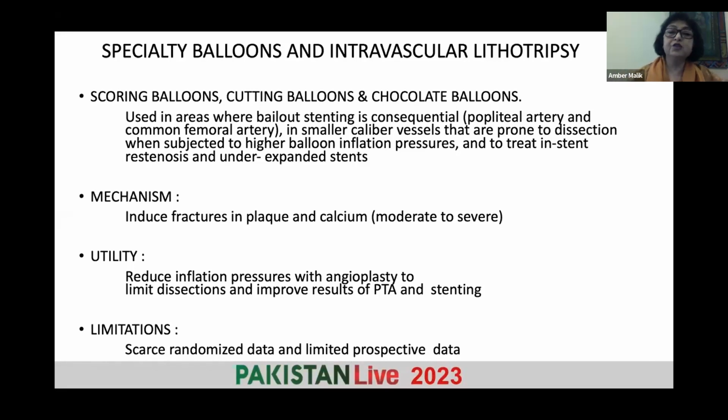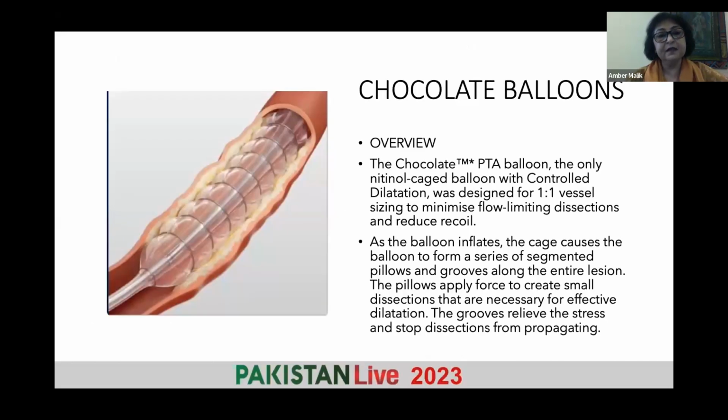They should be peripheral dedicated balloons. And there is one colleague, Khusro Niazi, who actually swears by chocolate balloons and says, I do not use rota or anything. In fact, just a chocolate balloon is fine to prepare the vessel. It induces fractures in plaque and calcium, moderate to severe, and as a result, it reduces inflation pressures with angioplasty to limit dissections and improve results of PTA. However, there is limited data.